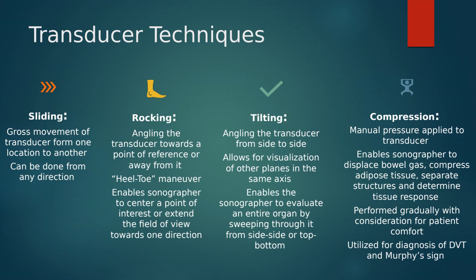I'm sure when you are the patient in lab and I am helping your partner, you feel the difference in pressure when I am scanning you versus when your partner is scanning you. We need pressure while we're scanning. I promise you, you're not going to hurt your patient. And even if you give a little bit of discomfort to your patient, you want to make sure that you're communicating and saying, I'm really sorry if this hurts in this area. I just have to push a little bit harder to get this picture. If you want me to stop at any time, you just let me know. Okay, but patients can tolerate more than we think they can, and they will communicate if they want to stop or if something is too uncomfortable for them.